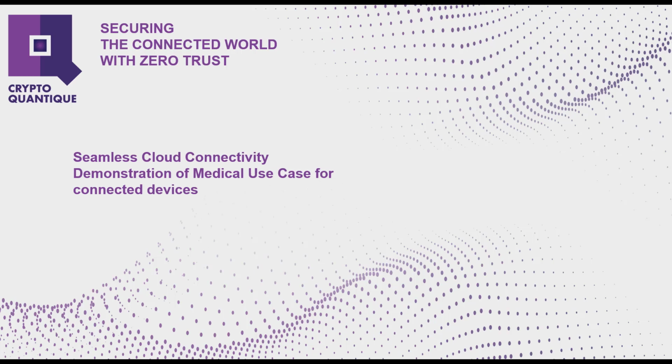In this video we will demonstrate the use of Crypto Quantique's Q architecture products, namely the QDID and the QuarkLink, which can be utilized to create a fall detection device that could be used for medical purposes in a care home, for example, to allow nursing staff to determine quickly the identity of a patient that has fallen.